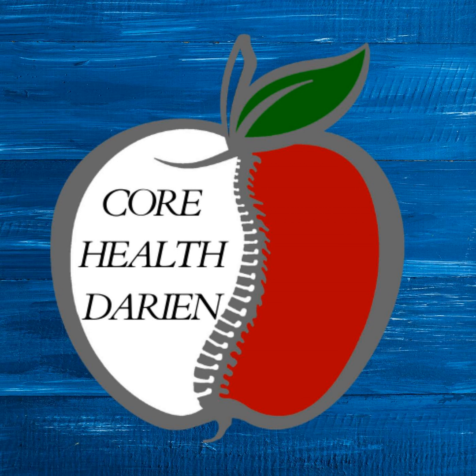So Graston was actually an osteopath. An osteopath is kind of a cross between a chiropractor and a medical doctor. They're more popular in Europe. There are schools here in this country, and Graston was an osteopath. What he did is he took his technique from Oriental medicine, basically coining, cupping, a whole bunch of different terms to describe it. What you do is you lubricate the surface of the skin, and you go in and use a tool. For Graston or IASTM, it's pretty much going to be a stainless steel tool or a very dense plastic these days, just as well.